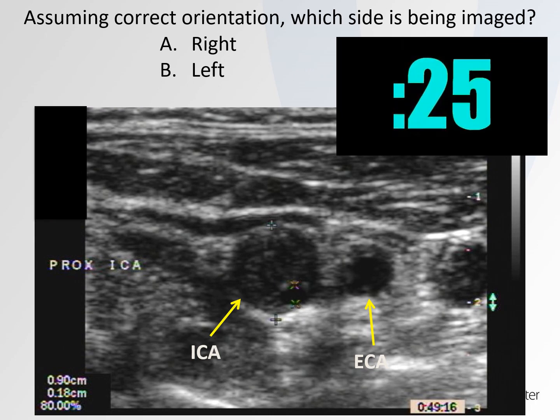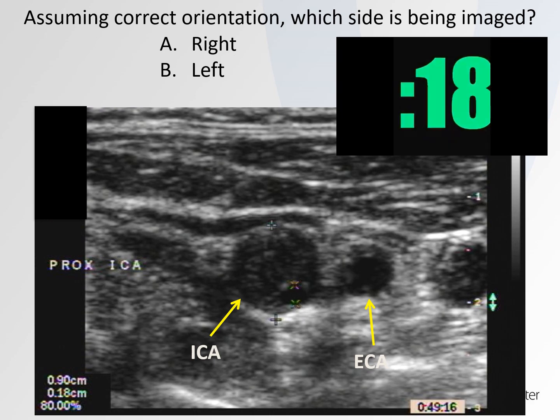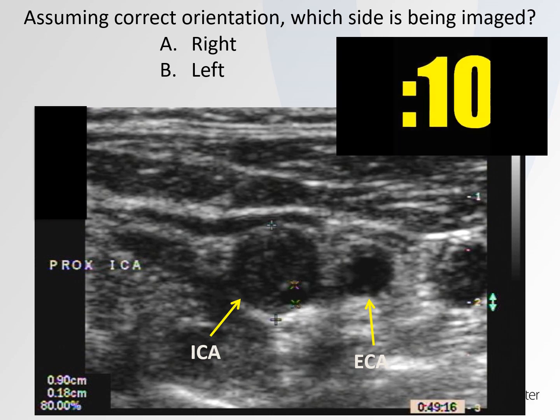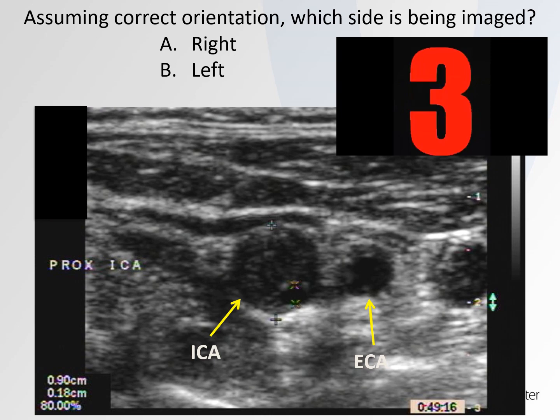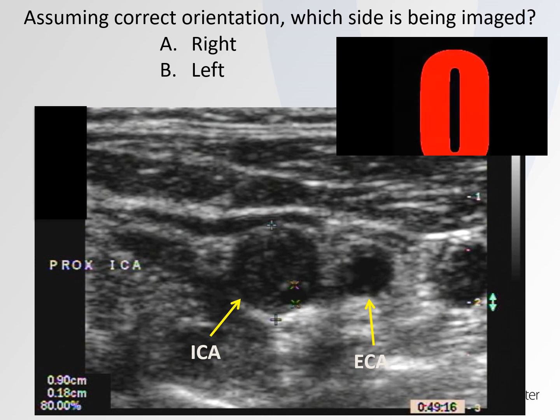You got all that? If that's the case, assuming correct orientation, which side is being imaged — is this the right side or the left side? So, did you get it right? Remember, in a transverse view you're looking from the feet to the head, so the patient's right is to the left of the screen. That means the patient's medial side is to the right of the screen — and therefore the external is medial. This is the right internal and external carotid artery.